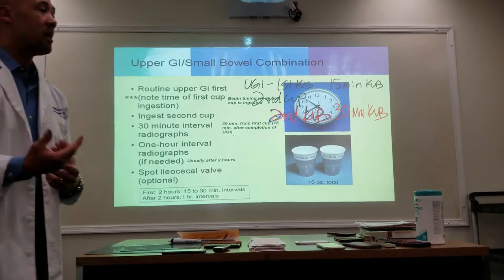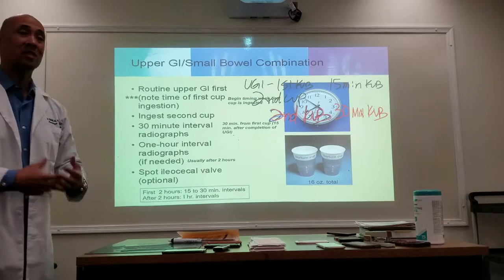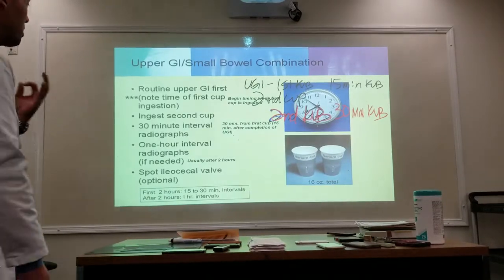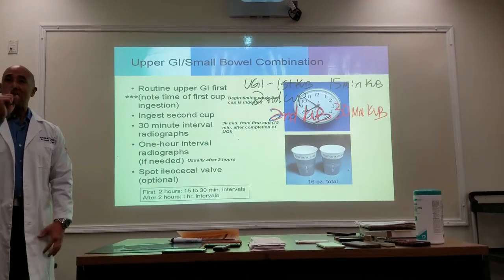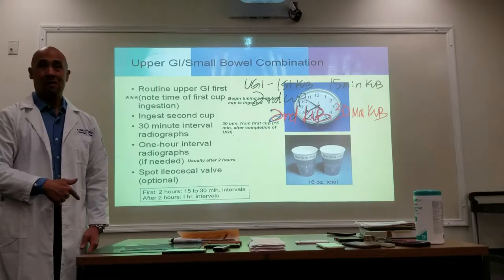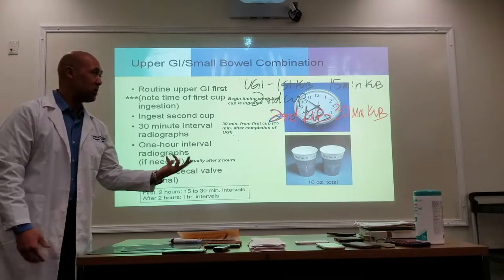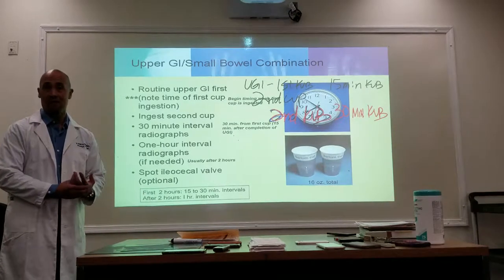It's also important, if they're here with family members, to let them know that these procedures can take anywhere from 15, 20 minutes to maybe 3, sometimes 4 hours. Why does it take that long? What are we trying to accomplish when we're taking these KUBs? We're waiting for the contrast to fill up the entire small bowel. Our digestive tract works differently from one person to the next. On average, the procedure shouldn't take more than 30, 45 minutes for their entire small bowel to fill up.